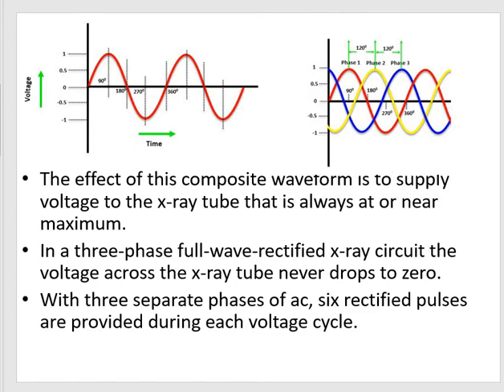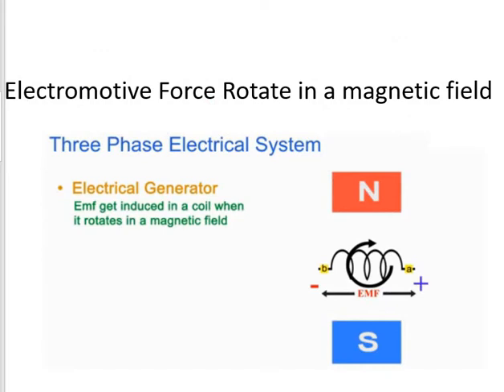The efficiency of a three-phase power supply is significantly higher than a single-phase power supply. A single-phase power supply uses only 2 wires, so the overall complexity of the network is less. However, when compared on power supply, it's a win for the three-phase power supply generator.